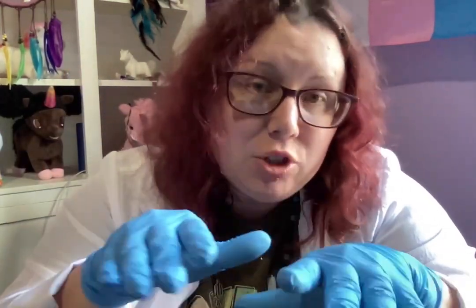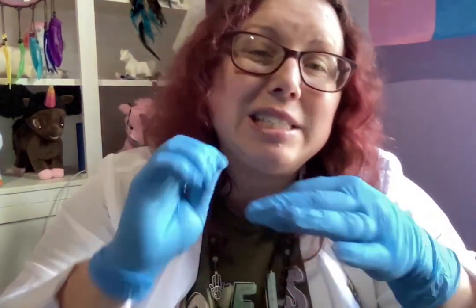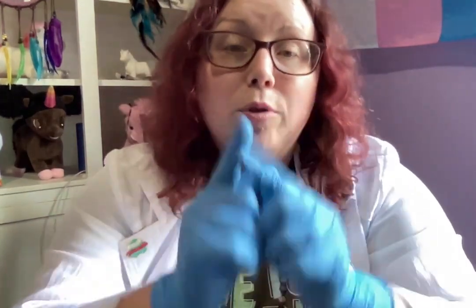Hey everybody, this is Stacy with Spectrum. I'm going to teach you how to do a subcutaneous injection today. I've got blue gloves on so you can see what I'm doing with my hands. The needle I'm using is much larger than what you'd traditionally use with a subcutaneous needle, so you can see what I'm doing. Your actual needle will probably be very tiny.